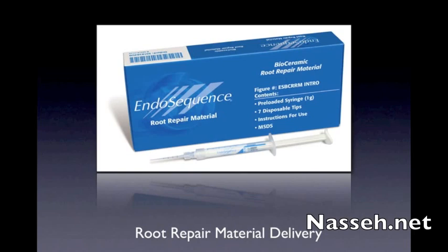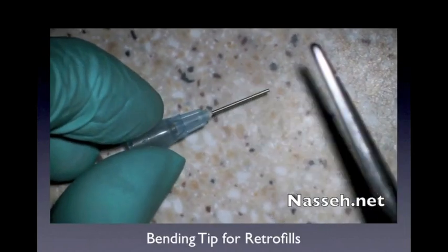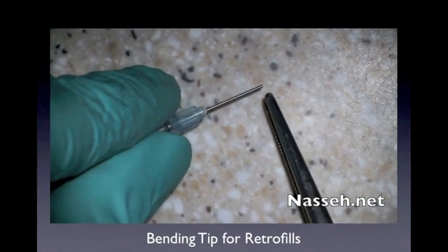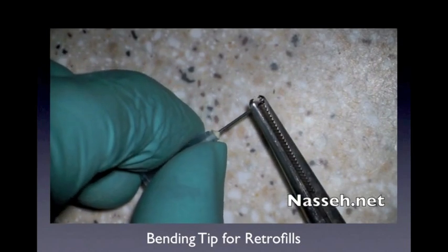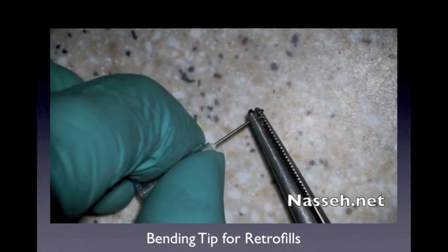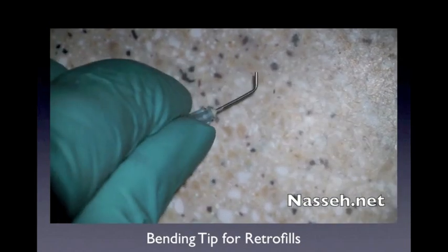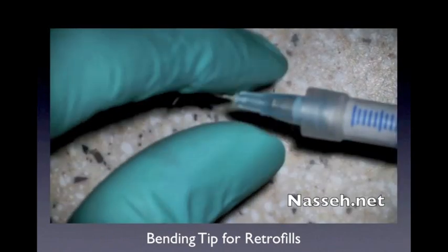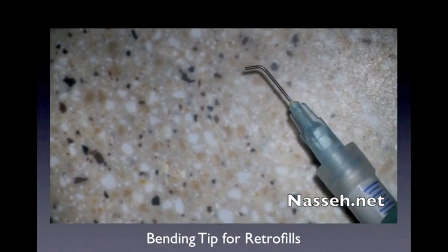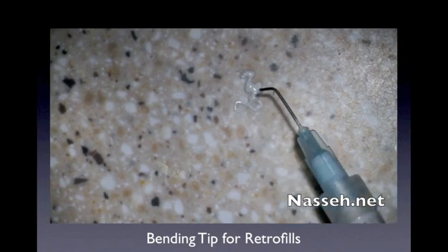As a result, I have this other little technique that I'm going to share with you about the preparation of a quick retro filling delivery tip. Any of the syringe delivery tips for either etching material or some of the viscous composite material available through several different companies can be used. You can use the bird beak plier or even the hemostat to bend the tip of these devices, and this allows for the delivery.